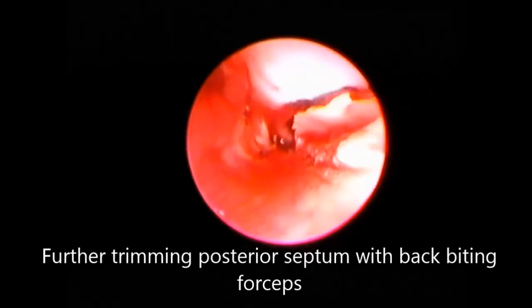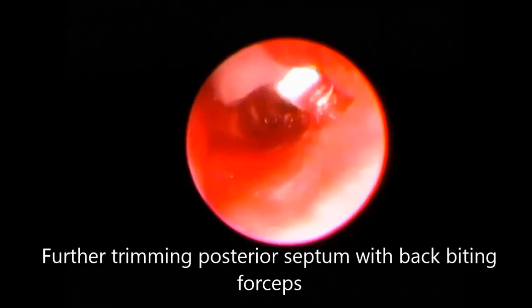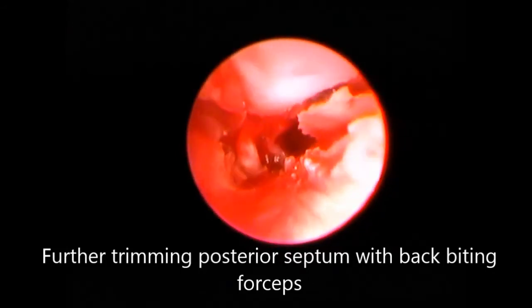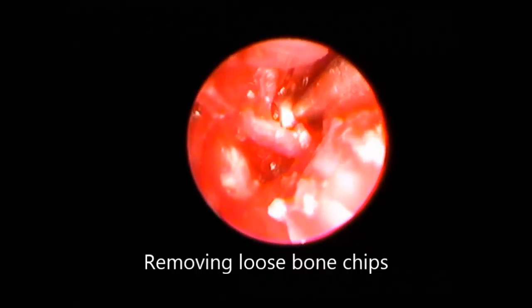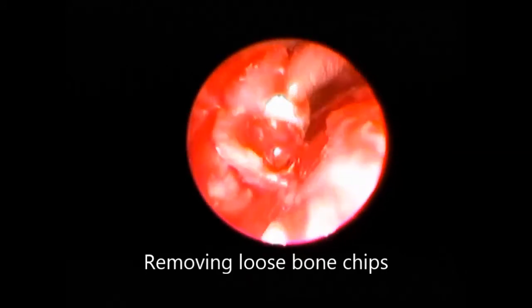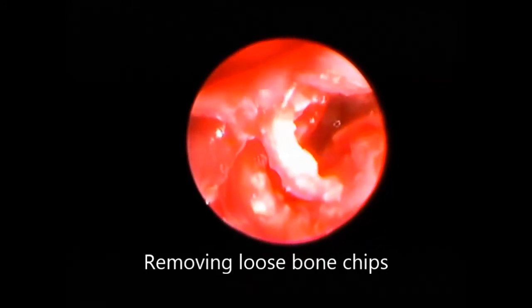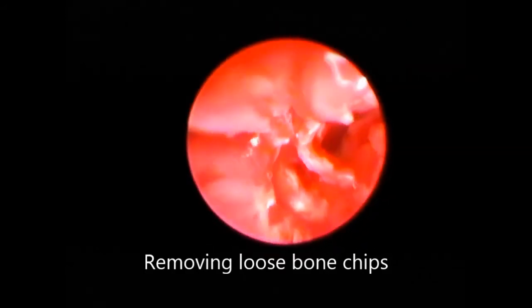This is the backbiting forceps in action. The loose bone chips were removed with the help of a curette, and finally with the Tilly's forceps.